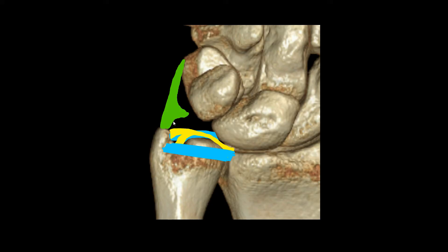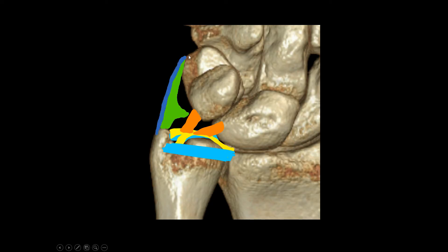The dorsal and volar radio-ulnar ligaments are also attaching to the rim of the distal radius. Then you have the ulnocarpal ligaments, and here the volar ones are especially important. You can separate them into an ulnar-lunate and an ulnar-triquetral ligament. The ulnar collateral ligament is an enforcement of the tendon sheath of the ECU tendon.